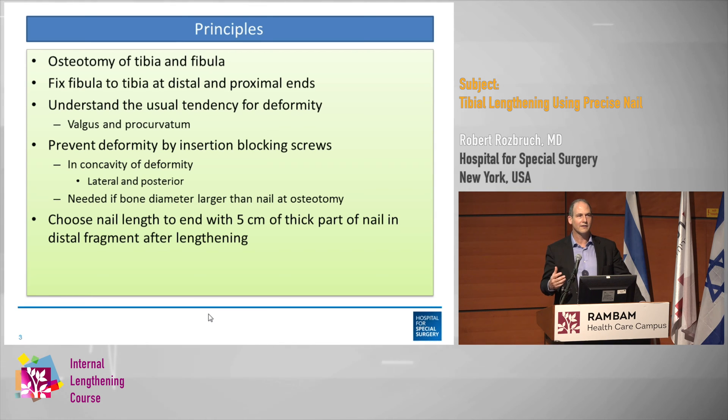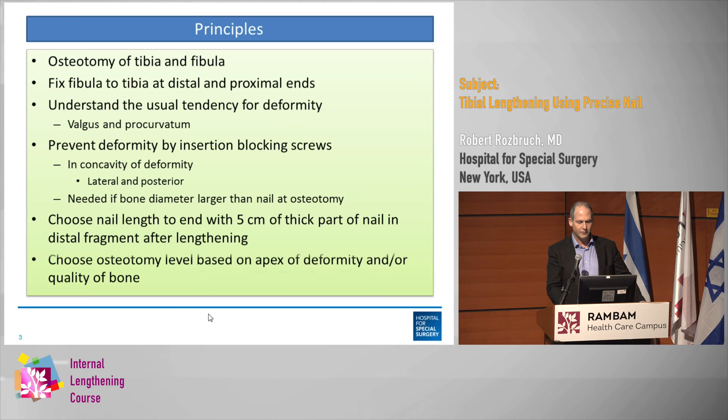Always make your nail long enough so that you don't end up with too little thick part in the moving fragment. I always like to shoot for about 5 centimeters. I usually choose the osteotomy based on the apex of the deformity or the quality of the bone.